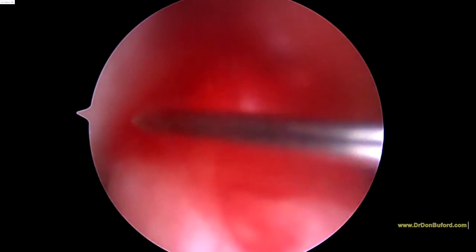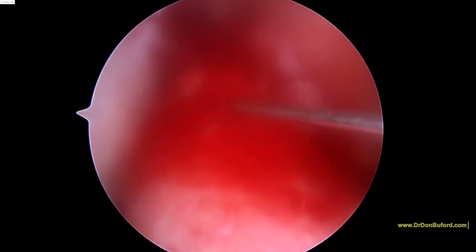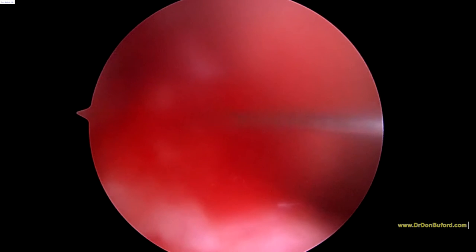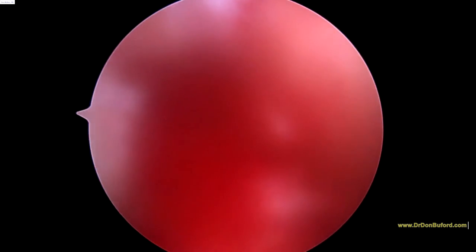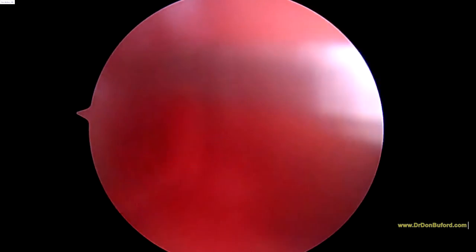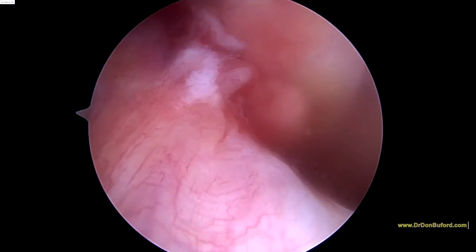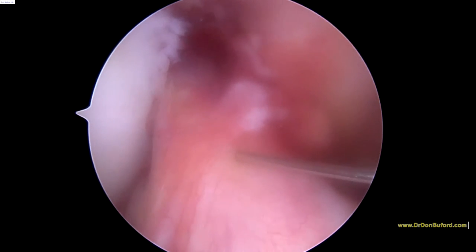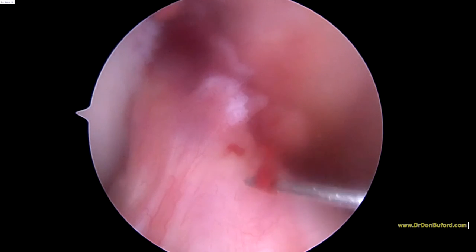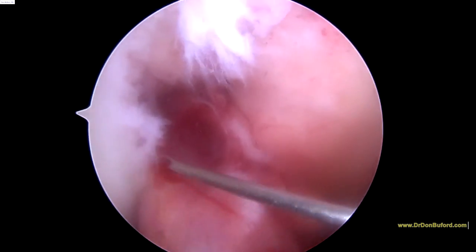Now we're trying to get to the base of the ACL here. Here we've got the tibial insertion, or origin, of the ACL. It's pretty well plumped up, so to speak. A little more in here. You can see how it goes right into the structure of the ligament.